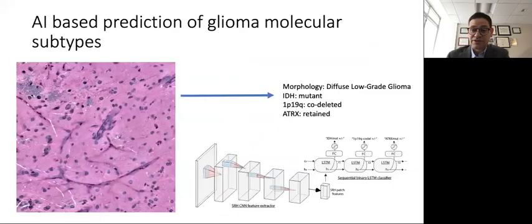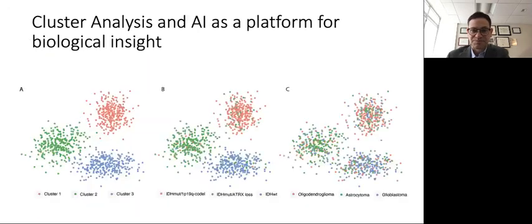Our vision for the future includes a pipeline where fresh brain tumor specimens are imaged with SRH, processed by the CNN, run through a feature extractor, and subjected to a sequential binary long short-term memory network to predict the likelihood of key genetic classifications. We also recognize the limitation of existing genetic classifications of gliomas and understand that classification systems will evolve, some of which will rely on methylation clustering, for example, that may become increasingly central to brain tumor diagnosis. Our larger aim is to generate a pipeline for CNN training that can be easily updated to reflect emerging systems for tumor classification.